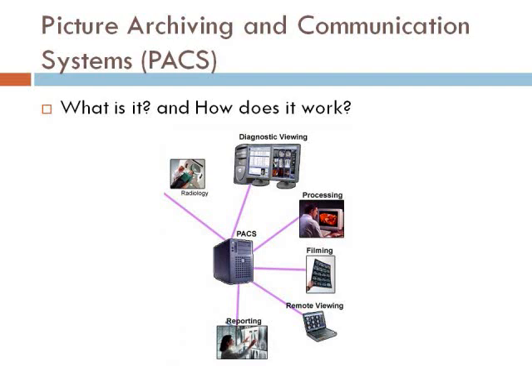So it allows instant access for the different physicians, the radiologist or the ordering physician or the nurses on the floor, whoever. It allows instant access to all the different clinicians in the hospital and even in the physicians' offices in the local area as well.